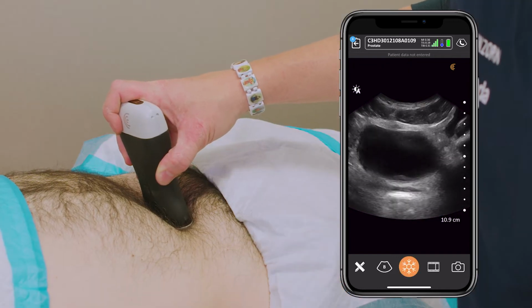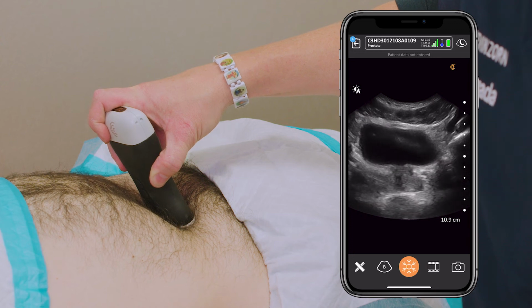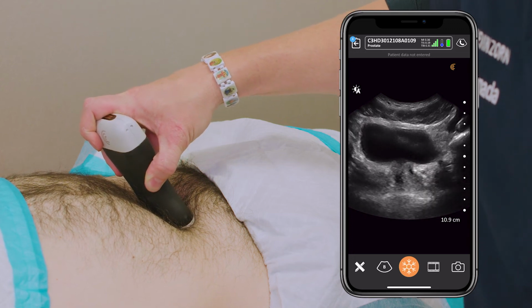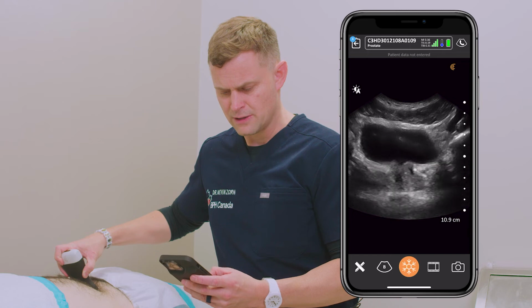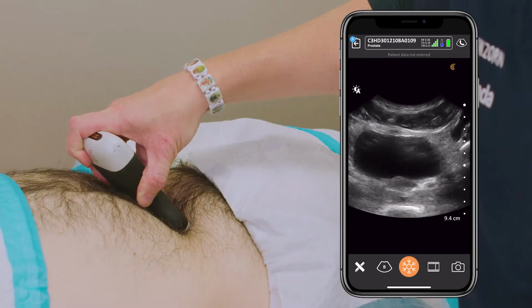Moving my way down at the bladder neck to see if there's any median lobe, any protrusion centrally of the prostate into the bladder. So here we can see the prostate in view. I can zoom in, centralize the image, and there we go. So I don't see any median lobe.